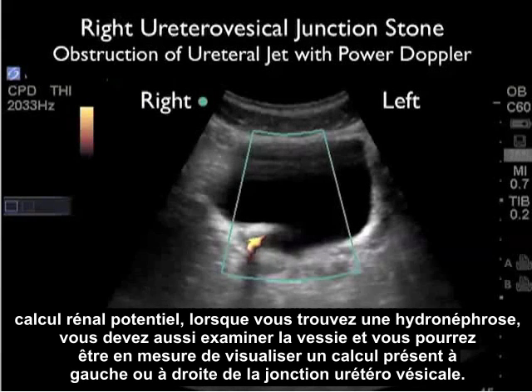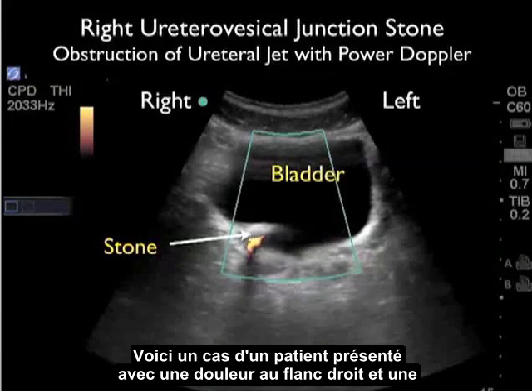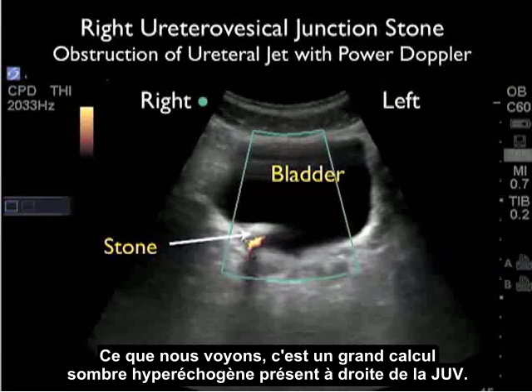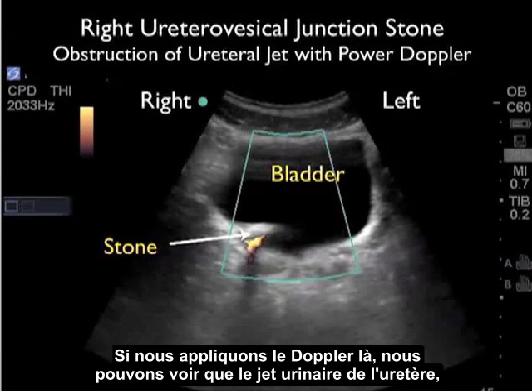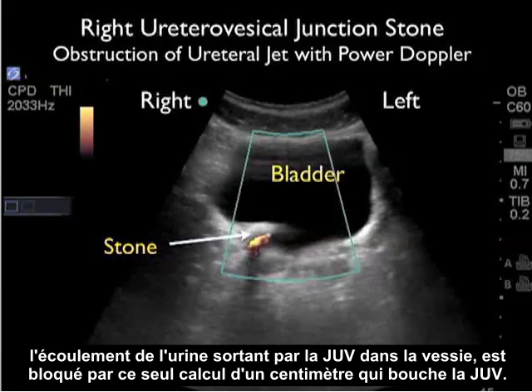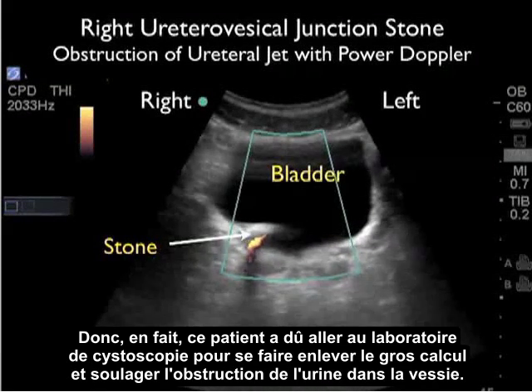When evaluating a patient with a possible kidney stone, when you find hydronephrosis, you should also look at the bladder and you may be able to visualize a stone present at the left or right ureterovesicular junction. Here's a case in which a patient presented with right flank pain and had right hydronephrosis. We're looking at the bladder in a short axis configuration with the marker dot over towards the patient's right side. What we can see is a hyperechoic large shadowing stone present at the right UVJ. Applying Doppler sonography there, we can see that the ureteral jets — the flow of urine coming out through the UVJ into the bladder — is being blocked by this one centimeter stone plugged at the UVJ. This patient had to go to the cystoscopy lab to get the large stone removed and relieve the obstruction.